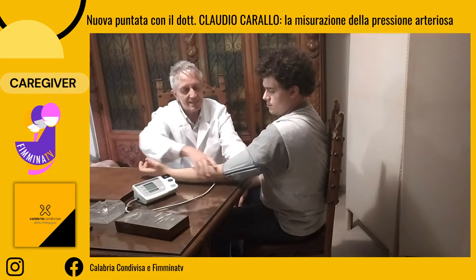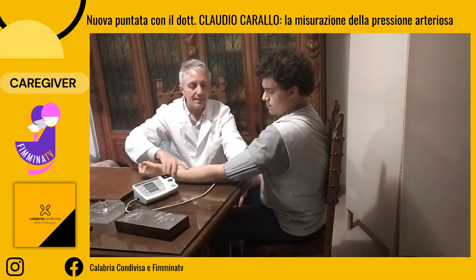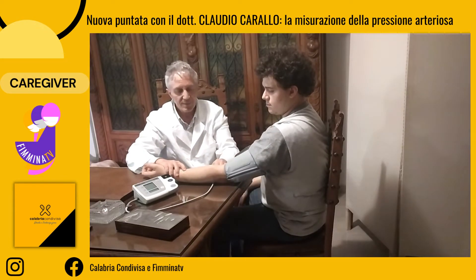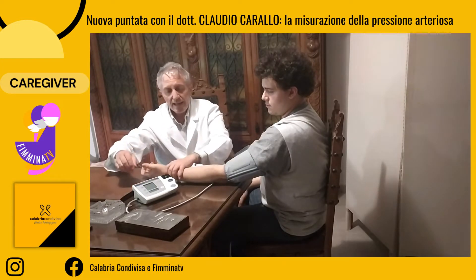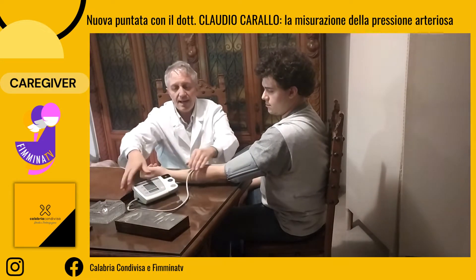Il bracciale deve essere posto al di sopra della piega del gomito. Il paziente deve poter piegare il braccio liberamente. La posizione dei tubi non è importante perché questi tubi non sono facilmente comprimibili. Se avete dei tubi, ponete i tubi lontani da pesi.